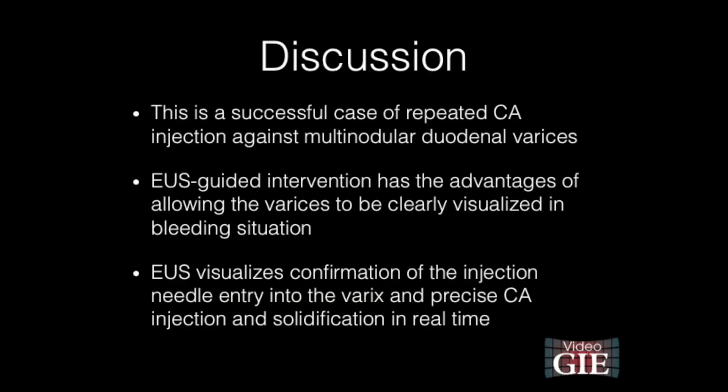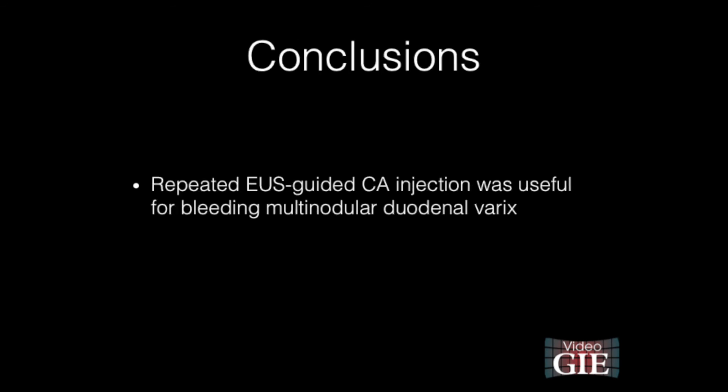This is a successful case of repeated cyanoacrylate injection against multinodular duodenal varices. EUS-guided intervention has the advantage of allowing the varices to be clearly visualized even in bleeding situations. EUS enables confirmation of the injection needle entry into the varix and precise cyanoacrylate injection and solidification in real time. Repeated EUS-guided cyanoacrylate injection was useful for bleeding multi-nodular duodenal varices.